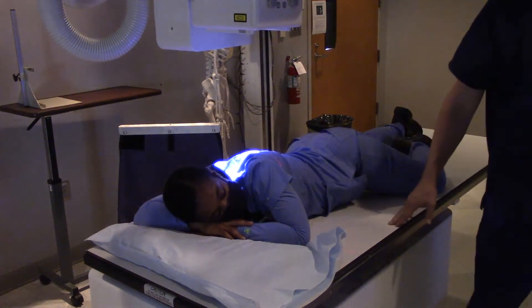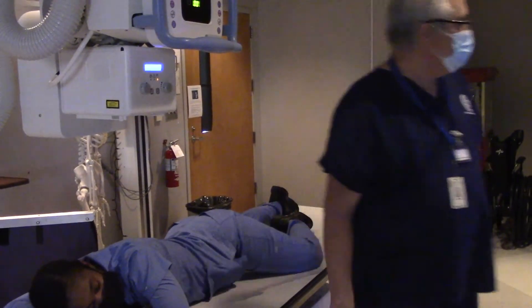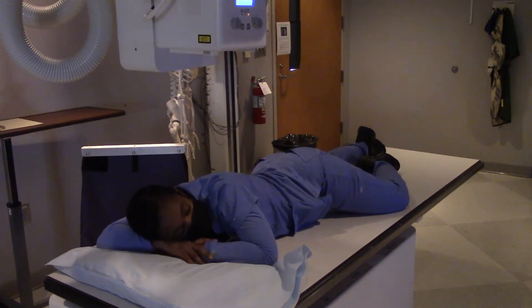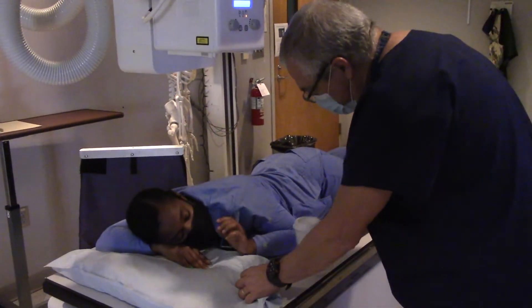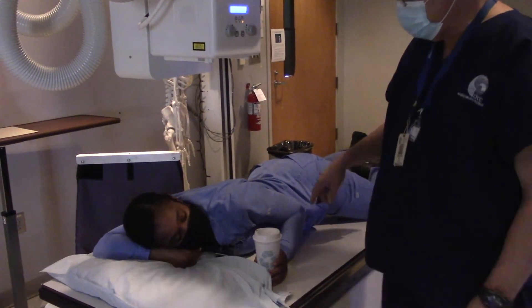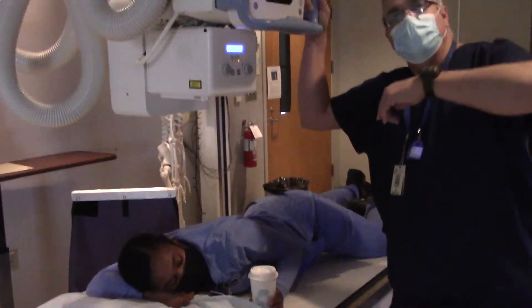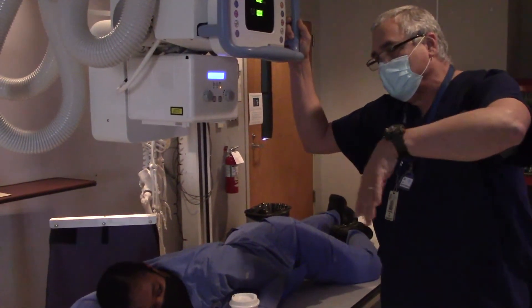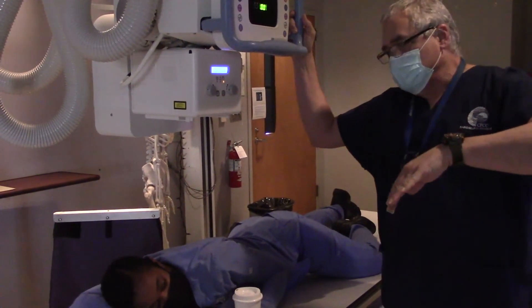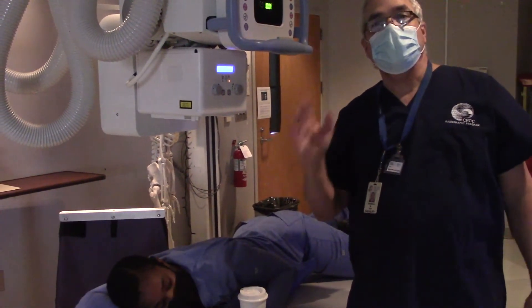Now one more thing that I'm going to need — something for this patient to drink. I need her to drink a cup of barium. Now I don't have a straw to go in it, but right here goes a nice cup of barium. Hold on to that with your hand — don't really drink that, that's my coffee. According to the book, we're supposed to get the patient to breathe out and hold their breath on expiration, but I'm not going to worry about breathing instructions right this minute. The main thing I want is for this patient to be drinking while I make my exposure.